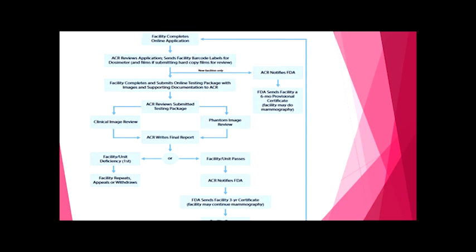So the whole process of accreditation, when I first saw one of these charts many years ago, I had to laugh because I was like, oh, well, this is a complicated flow chart. But we've gotten it down to something relatively simple, where the ACR reviews your application. Not that the completion of the application is an easy process, because if it's an initial application, there's a lot of paperwork that has to be generated. And that's when all these initial qualifications for all of your different personnel come into play.